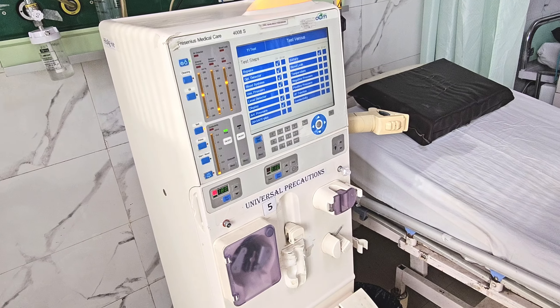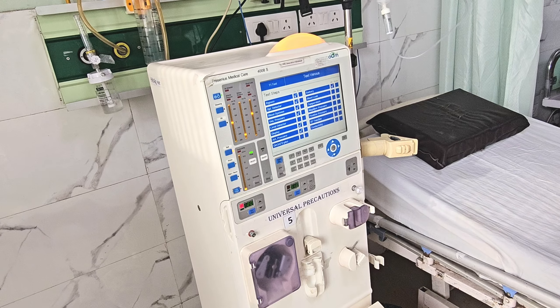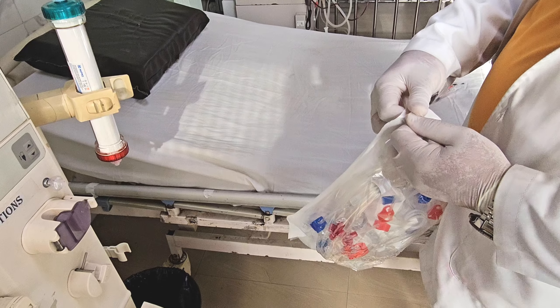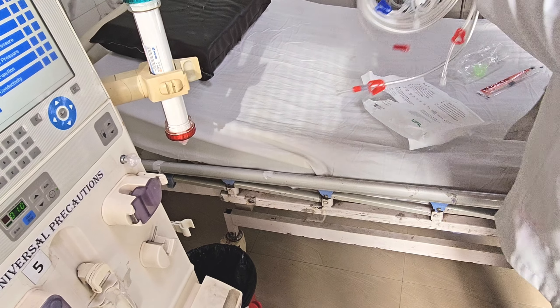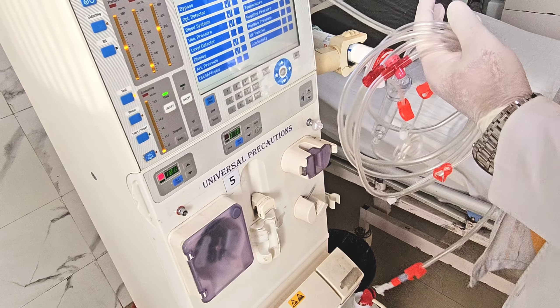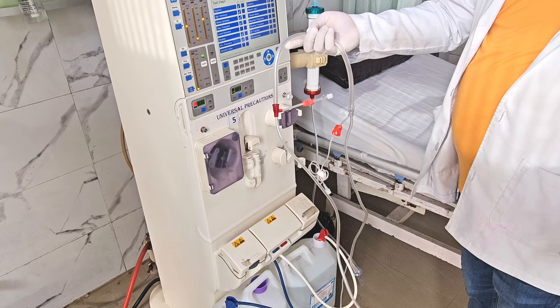Once each individual step is completed, the column will change to green color. The normal saline bottle with IV set is being connected to the stand attached to the dialysis machine. The dialyzer pack has been opened and connected to the machine holder. Now the tubing set is being opened. To avoid confusion: there are two separate tubing sets. The red-colored tubing connects to the red side of the dialyzer — this is the arterial circuit, which takes blood from the patient to the dialyzer.